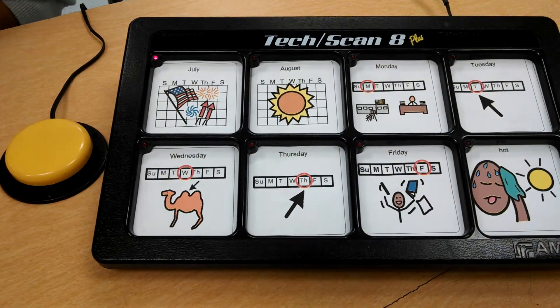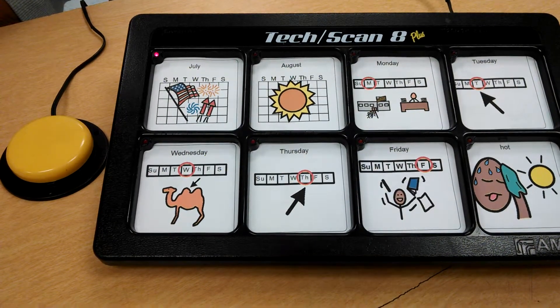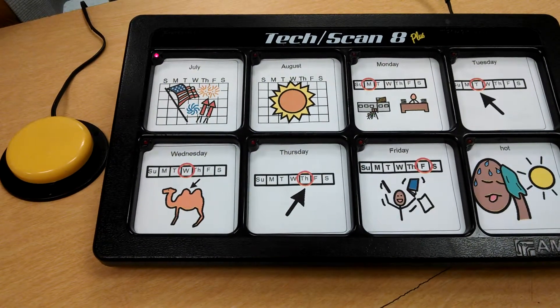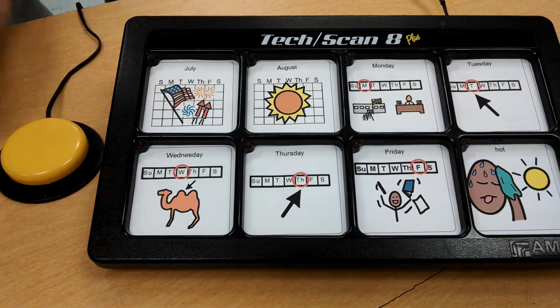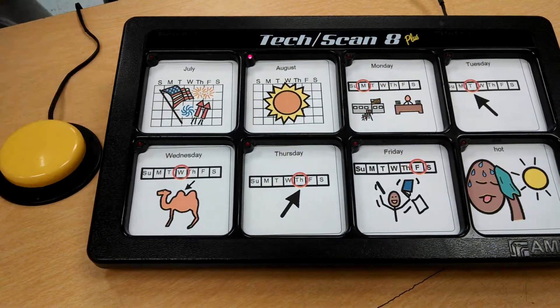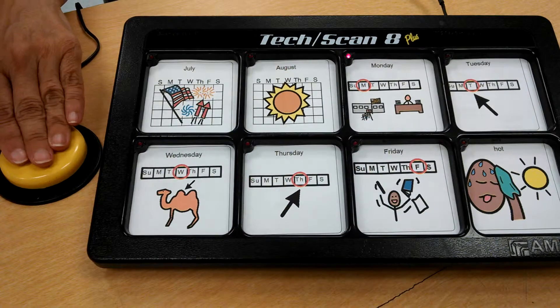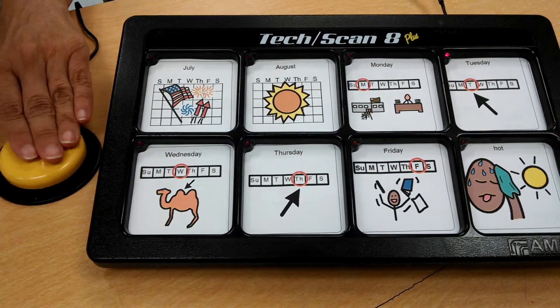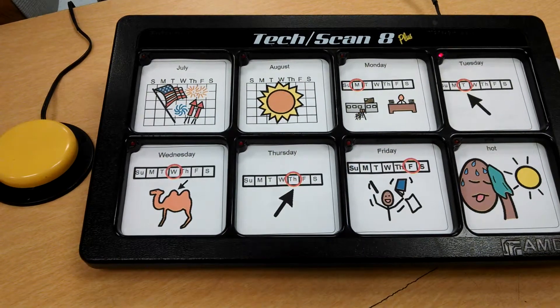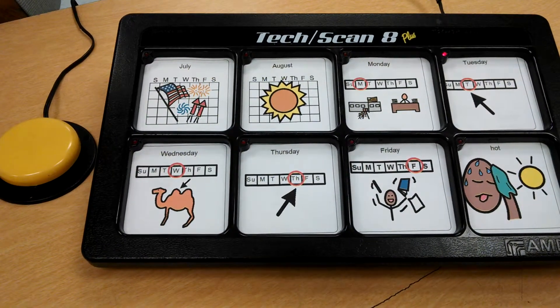For example, the device says 'July' and then 'The month is July.' But if you didn't want July, you would hit the switch again — 'August' — and continue to hit the switch — 'Tuesday' — until you got to the message you wanted. Then it would say 'Today is Tuesday.'